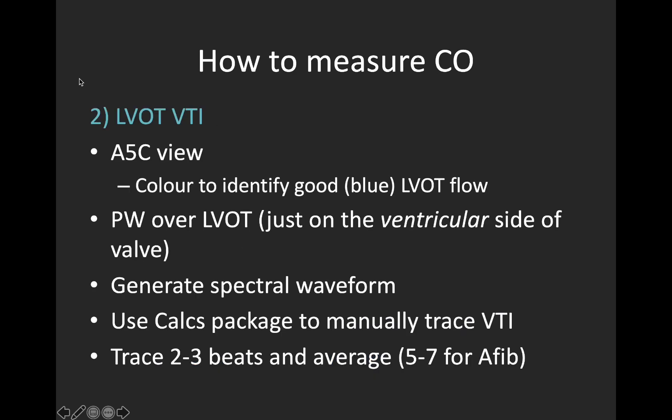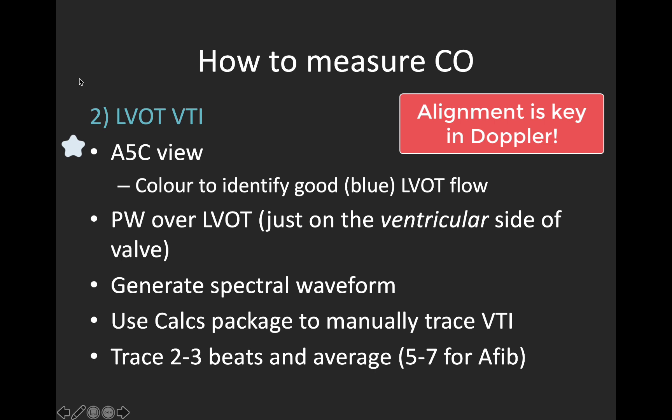The second step is to measure the LVOT VTI. We're going to use an apical 5-chamber view, since this allows us to visualize the LVOT itself, and we want to optimize the alignment of our view so that blood flow is parallel to the Doppler line of interrogation. Remember from principles of Doppler that angles are very key — we want to be as parallel to flow as possible. I like to use colour first as a check to ensure a good strong signal through the LVOT; we should see a nice strong signal of blue blood flowing out. We then use pulse wave Doppler over the LVOT — we need PW Doppler for its spatial precision to ensure we're at the same spot where we measured the LVOT diameter and that we're not capturing post-aortic valve velocity, which will be higher. It's really important to have the PW gate placed just on the ventricular side of the valve.